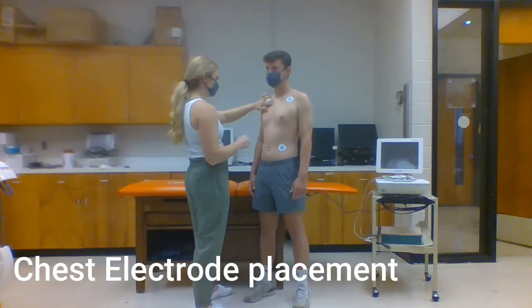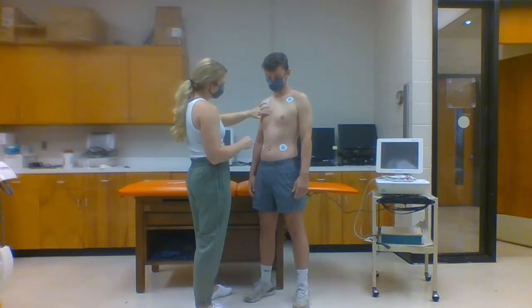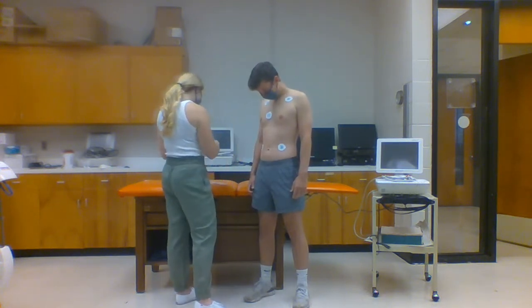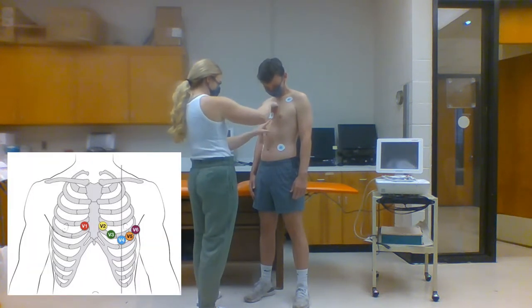Now we will place the chest electrodes. These leads all give us horizontal or transverse plane views of the heart and are considered to be unipolar. We refer to these leads and electrodes as V1 through V6. Each is placed in an intercostal space, the space between ribs. To locate the intercostal space where you are to place the electrodes, first find the participant's sternal notch. Slide your index finger to the right, past the sternum, then bring your finger down until you feel a soft tissue space. This is the intercostal space.